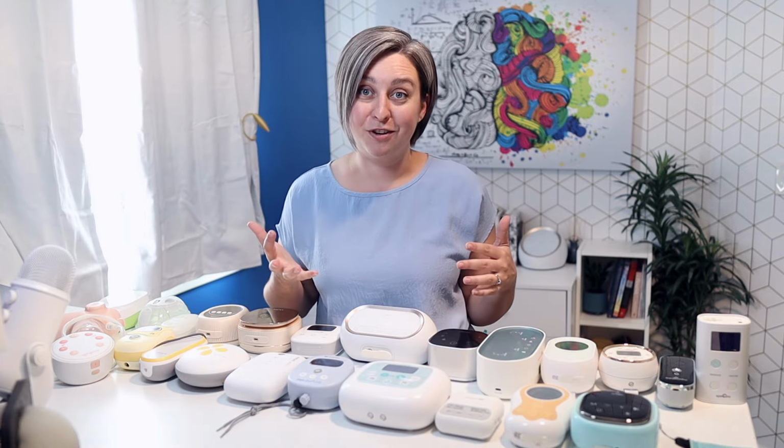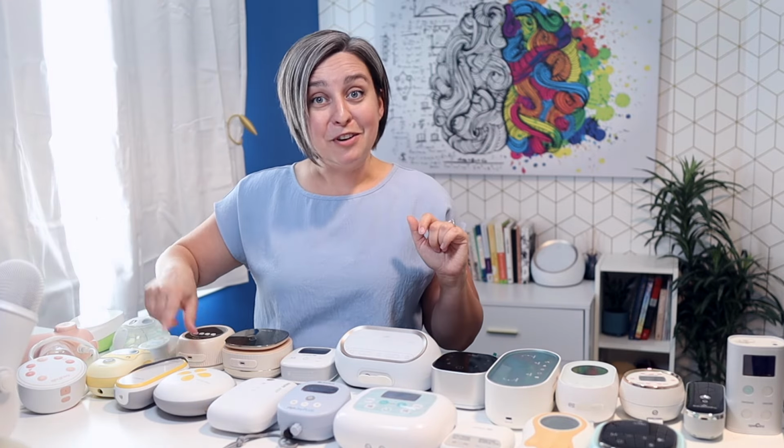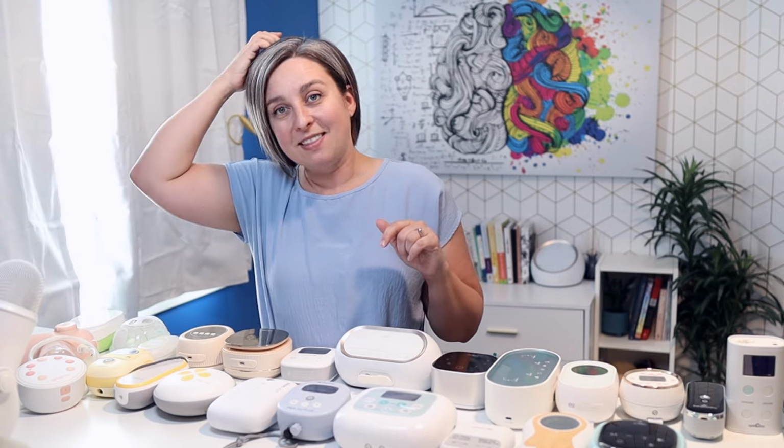Again, in the previous video, the original Momcozy Maya, I really struggled to get good suction on. The Plus is better. Philips Avent, Medela Swing Maxi, Medela Freestyle Flex, Medela Freestyle, and then the Annabella pump at the end. With the Annabella pump, I can get about 200 mmHg. Again, that's kind of a difficult pump to test, and that's an approximate, which is probably going to be plenty, especially for single-sided, because you'll be surprised how much suction some of these pumps lose when we do double pumping.